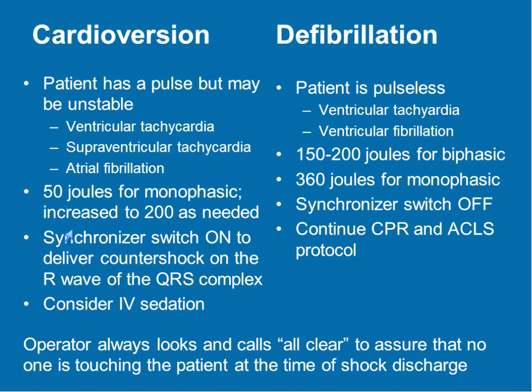So, synchronizer on will flag the R waves so that the impulse that is going to produce the depolarization does not occur on the T wave. Now, if you have the synchronizer switch on inadvertently and you need to defibrillate the patient, well, in VFib, there are no R waves to flag. So let's say you have the paddles in your hand and you push the button. Nothing happens if the sync button is on because it's looking for R waves.